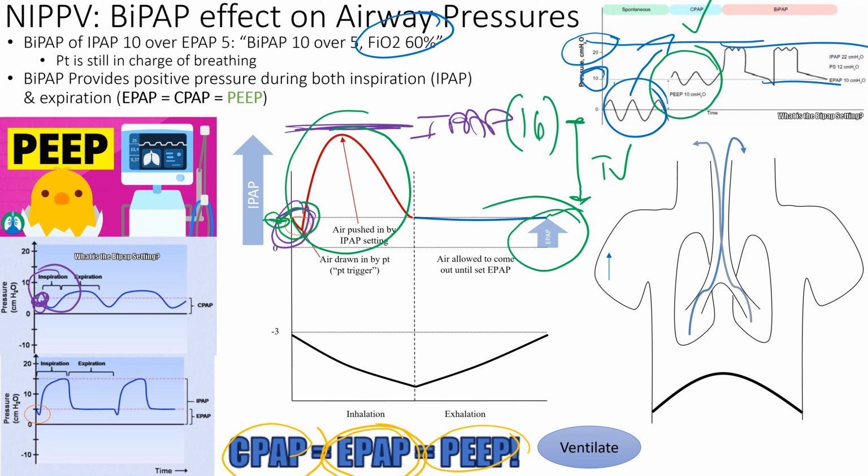So if they're 12 over 5, 100%, right? We know two things can affect someone's oxygen, right? So we can increase the low number, the EPAP, right? We could go 12 over 8, let's say, or 14 over 8. Let's increase that bottom number to help oxygen, because it sounds like you have an oxygenation problem, okay? If it's 12 over 5, 100%, yeah, they could have a CO2 problem. We just have to look at the ABG to see why they have that big difference, right? What's going on? There shouldn't be that much disconnect, if you see what I'm saying.